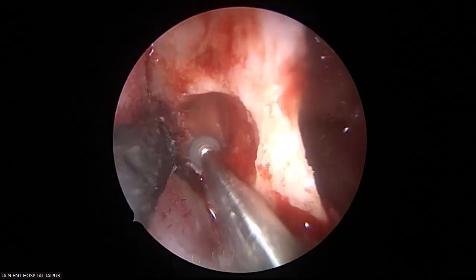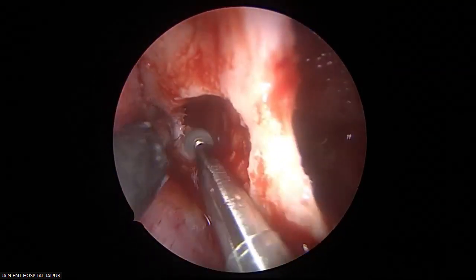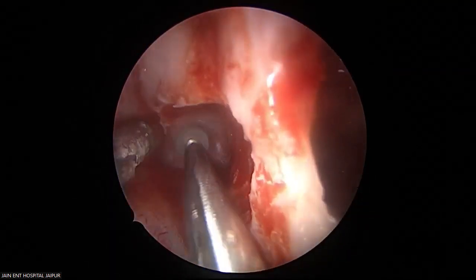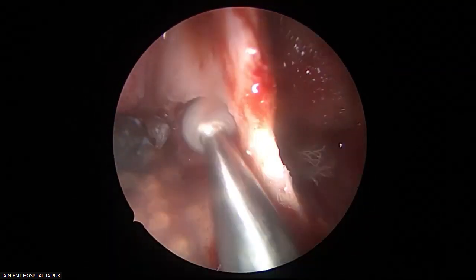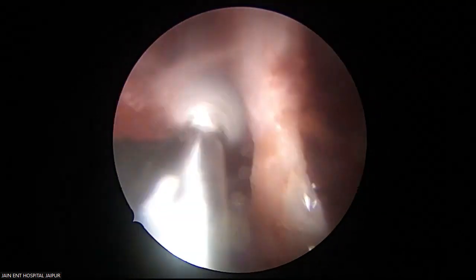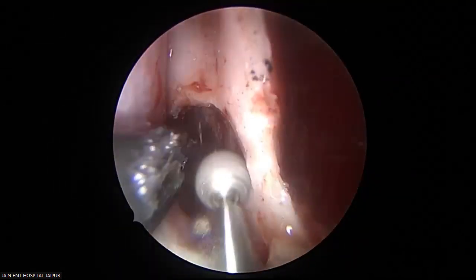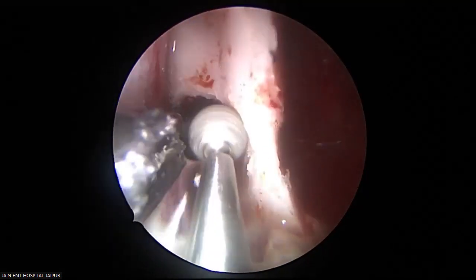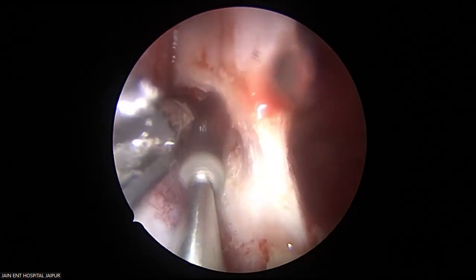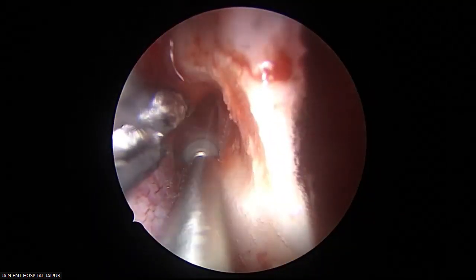This is my classical stylus from Medtronic. This is a coarse diamond, 4.5 millimeter, using 75,000 RPM with irrigation, under vision, 15-degree shaft, shaft not coming in the way. And you know, it makes your life so much easier.